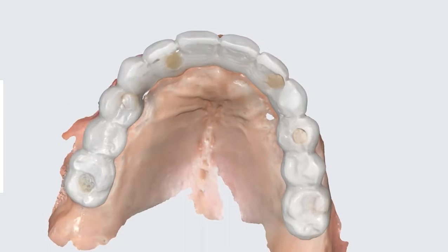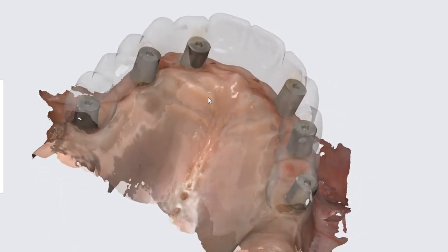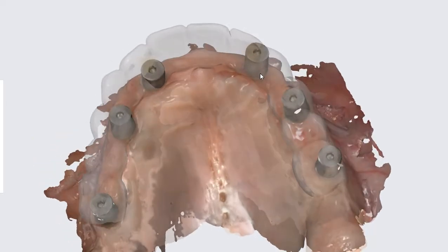You can see an overlay of the multi-unit abutments in the patient's mouth. I'll also scan the tissue, which is important with these scan bodies.